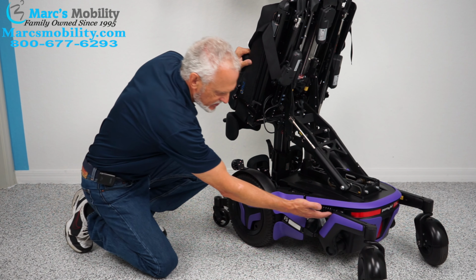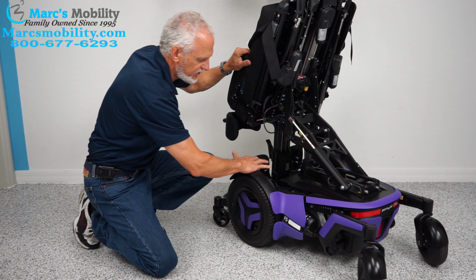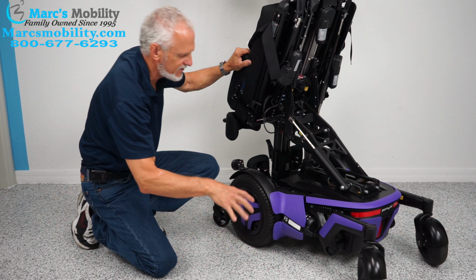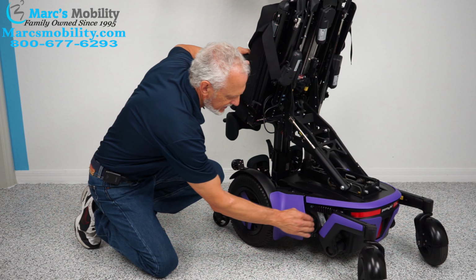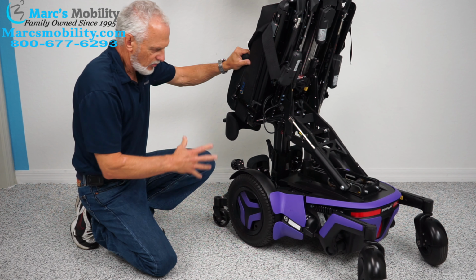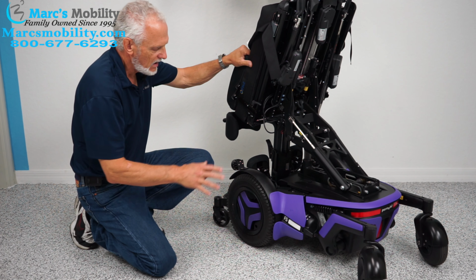You have suspension here for the rear fork, and you have another suspension for the front. So you have four of these shocks right here, and they are adjustable. There's an adjustment to make the suspension tighter or looser. You have a motor for each wheel. You can see the end of the motor right here with the release. If I want to push this chair and I want to roll it around, of course I would make sure the seat is down.